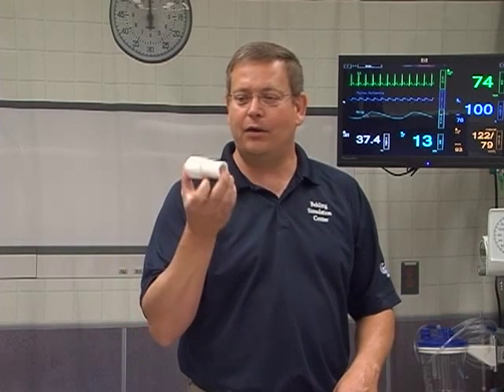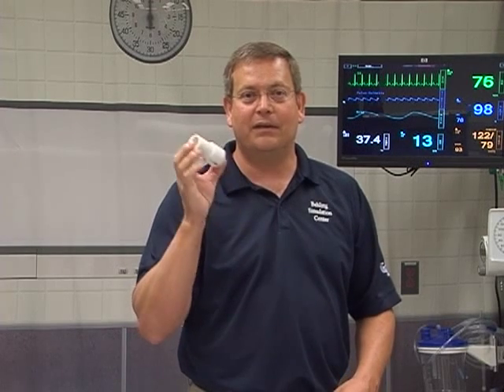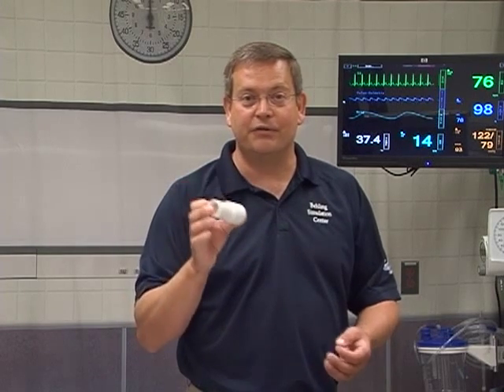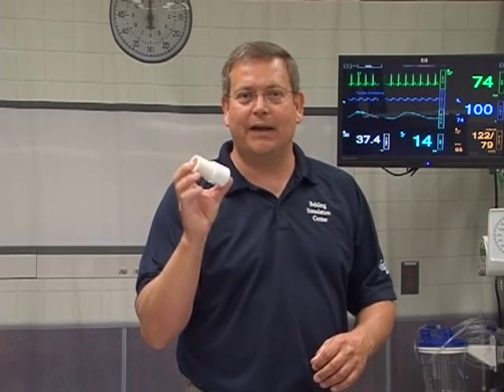You need a functional uterine cervix model. Who doesn't, right? Today we're going to build this model. I know it doesn't look like much — a piece of PVC pipe and a cap — but this little powerhouse can do endometrial biopsies, DNCs, and a host of other gyne procedures. So let's take a minute and put this little guy together.